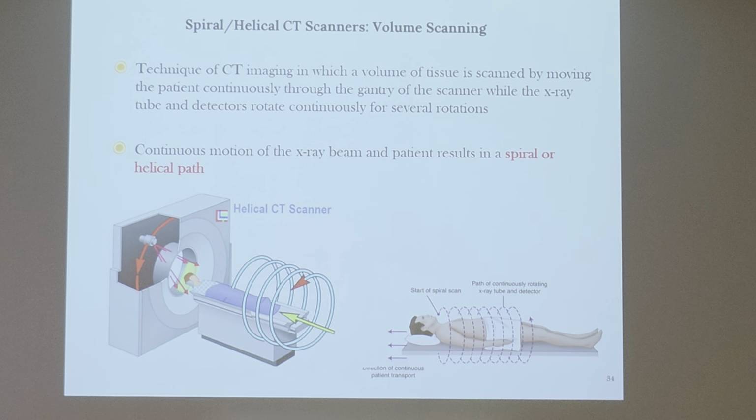Aim the laser, and it goes to the protocol. Some people, when you go in, you're not going to go for a Towns and aim at the glabella. It's like when I asked, where do y'all send your first chest X-ray? Somebody said T7. Where do you collimate to?